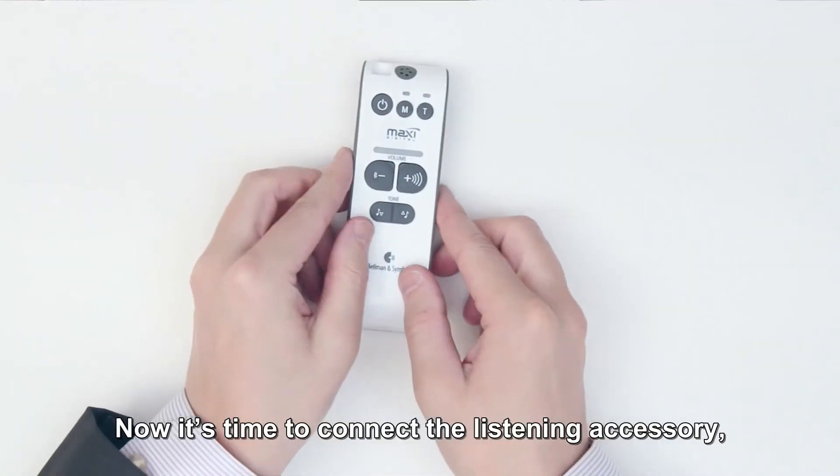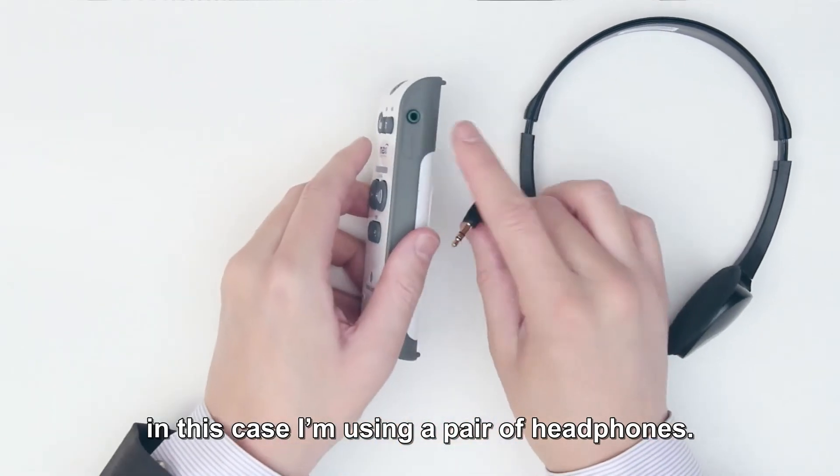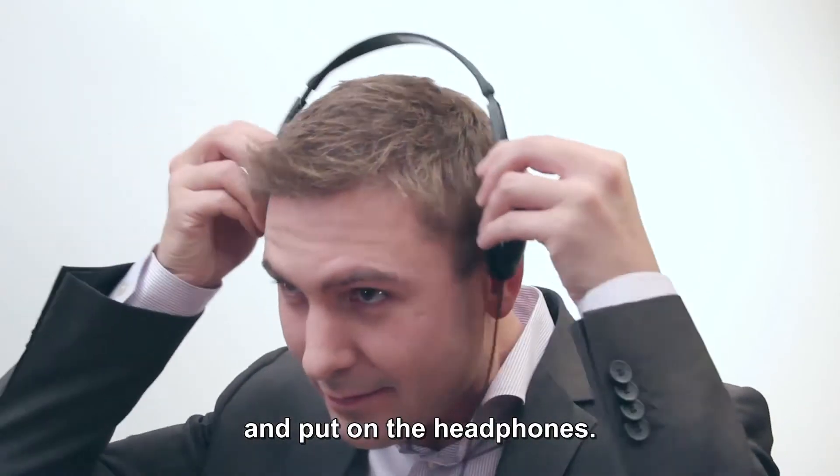Now it's time to connect the listening accessory. In this case, I'm using a pair of headphones. Just insert the tele-jack plug into the socket here and put on the headphones.